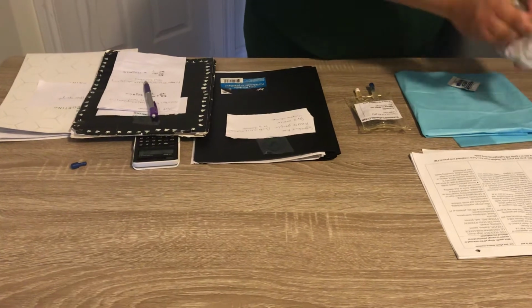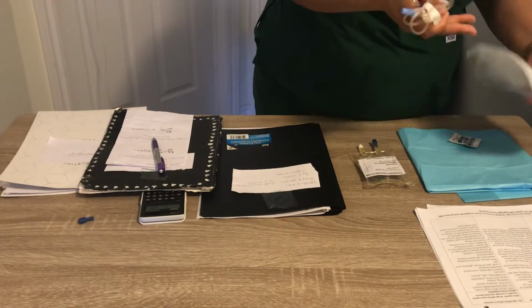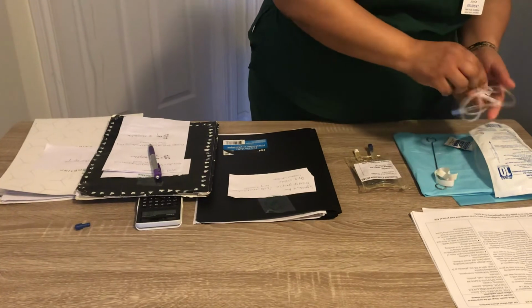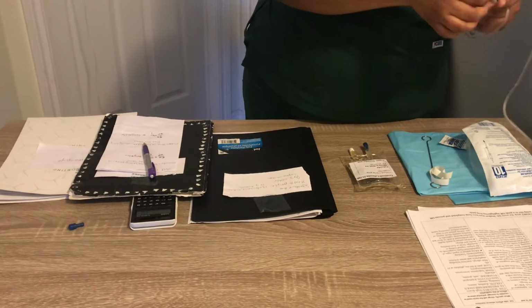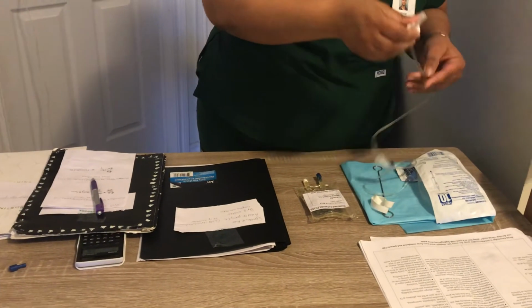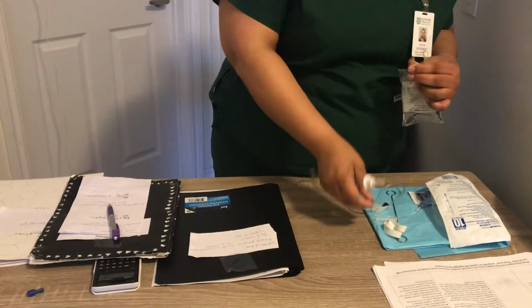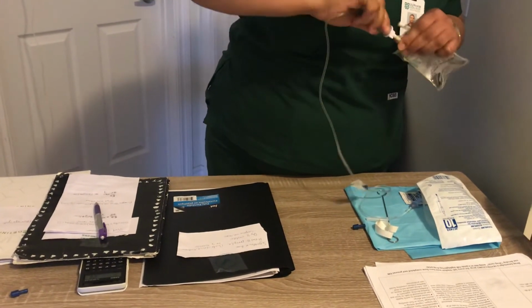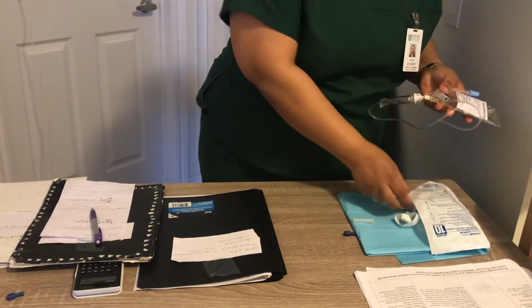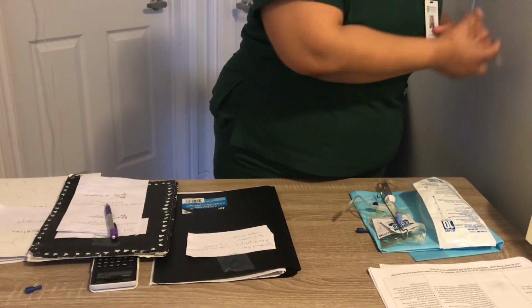Okay, so I'm going to open the secondary medication line. Okay, and I'm going to close the roller clamp right away. Okay, maintaining sterile asepsis, I'm going to spike my mini bag. Okay, once that's done, I'm going to gather my supplies with my alcohol swab. And before I do that, I'm going to perform hand hygiene.